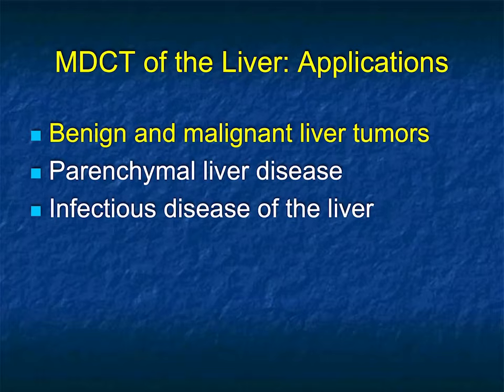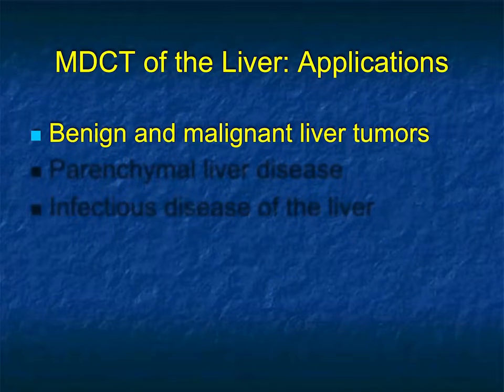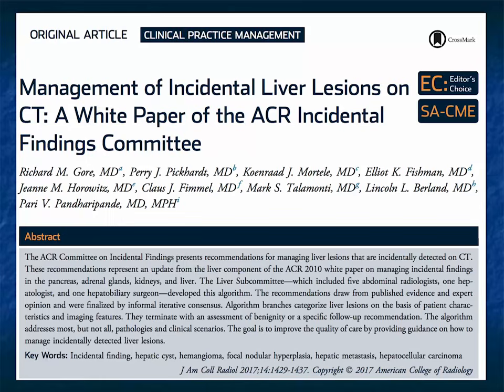Now, in this talk, I want to go through very specific lesions, show you the classic appearance, and then also show you some of the non-classic findings as well. We're not going to have time for parenchymal disease. We'll mention that only if it relates to the primary masses in the liver. And we are going to talk about infectious lesions only in part because they can be great mimickers. Patients with FUO can have metastasis, can have lymphoma, can have hepatoma, or can have a liver abscess. So you at least need to be thinking about that when you're making a differential diagnosis.